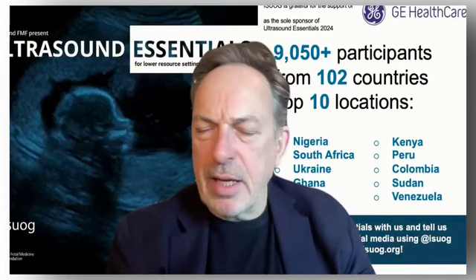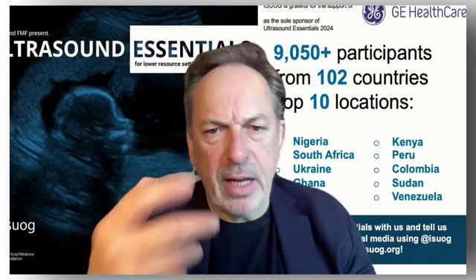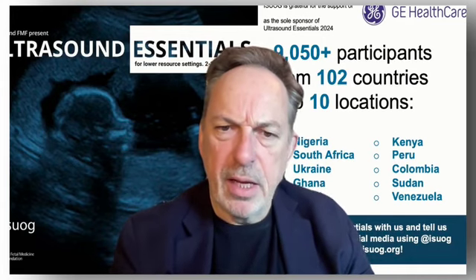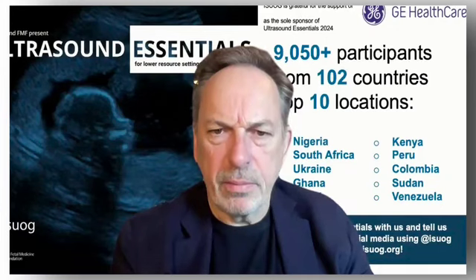How many times do you, in routine practice, if you can't see the endometrium, put saline in and do a sonohysterography? Or do you think that's only if you think there's focal pathology? How do you feel about that? Yeah, if the patient is asymptomatic and postmenopausal and I can't see the endometrium, probably I advise to do nothing because there is no reason.